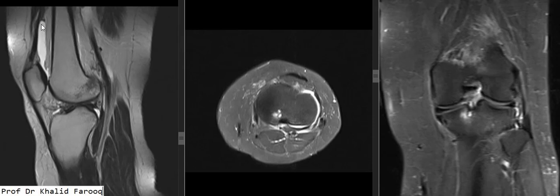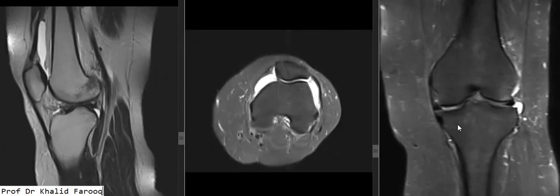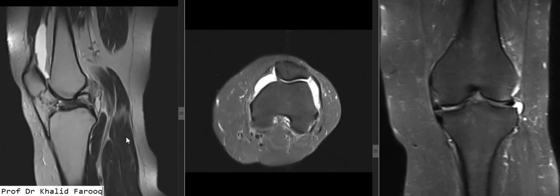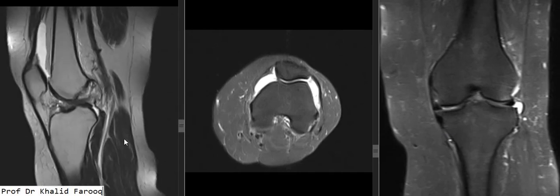The quadriceps and patellar tendons are normal. So this is an example of total ACL transection resulting in anterior tibial translation with a small amount of joint effusion. Thank you very much. Assalamu alaikum warahmatullahi.